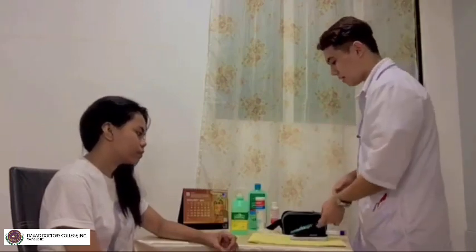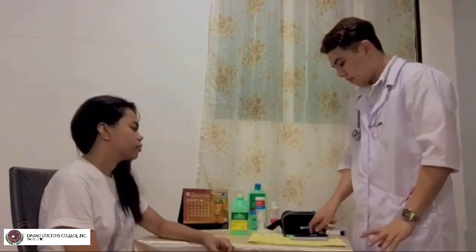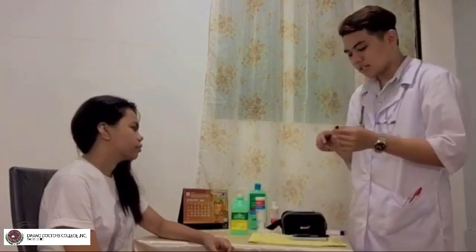Okay, so before that, the temperature is normal, ma'am, okay? Orally normal imong temperature. So now, mag-hand hygiene lang ko para makaproceed sa next assessment. Okay, so the temperature, ma'am, is 36.5, which is normal.